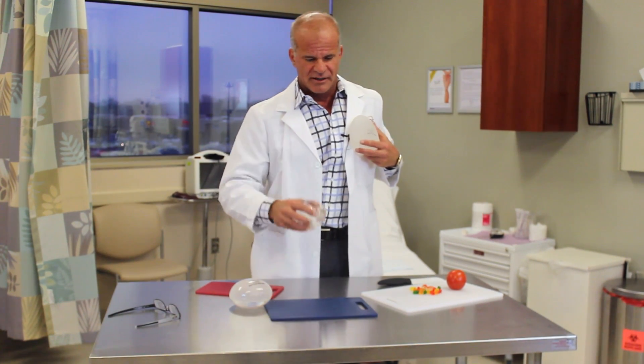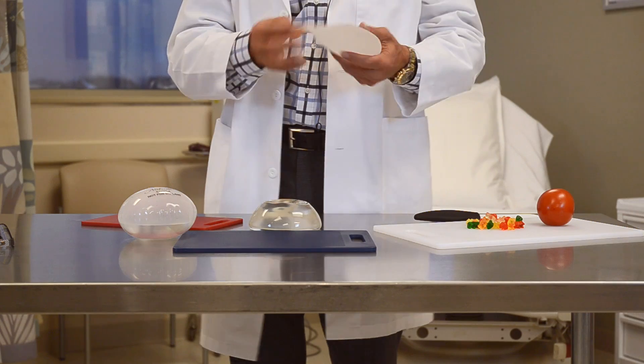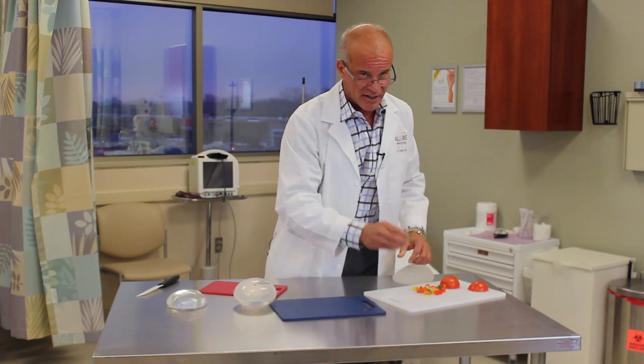The regular implants sit right over your nipple. These ones sit higher — the nipple is right here — and the material on the entire side is silicone, but it sticks together.